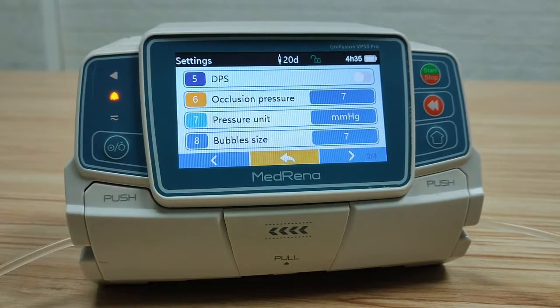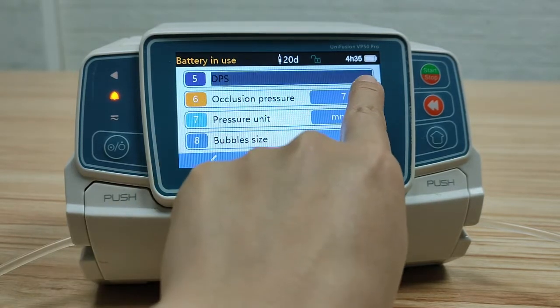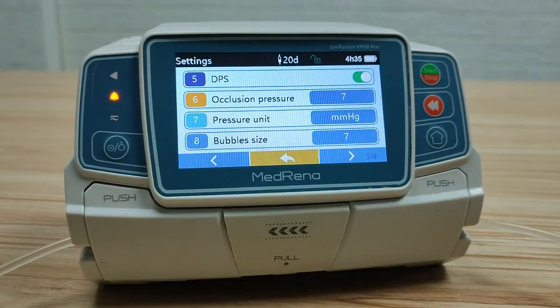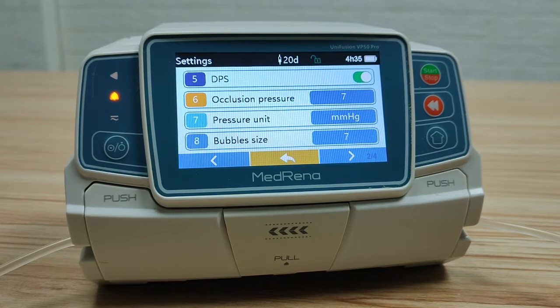DPS — Dynamic Pressure System. When it is on, the pump will prompt alarms when an occlusion happens or is about to happen, and also when there is a sudden drop in pressure.